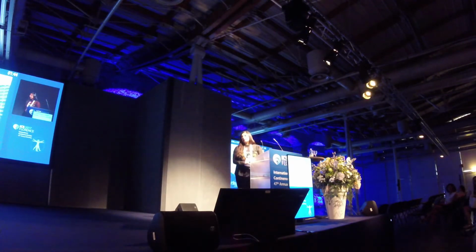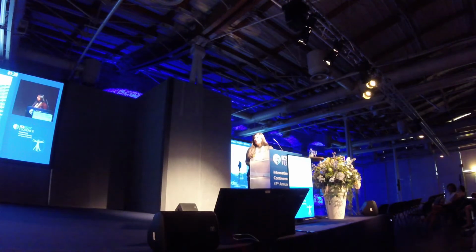Yes. Because to evaluate all the pelvic floor, anterior, apical, and posterior, the dynamic MRI looks to give an overview of the different compartments. But it's time-consuming and costly. So probably the opportunity to assess the pelvic floor with the ultrasound is more specific. The problem is how many experts can be utilized to assess this kind of complex evaluation, because it needs knowledge about bladder, about uterus.